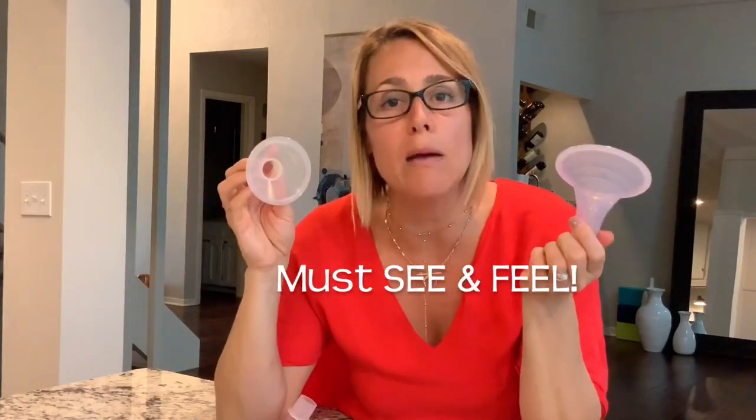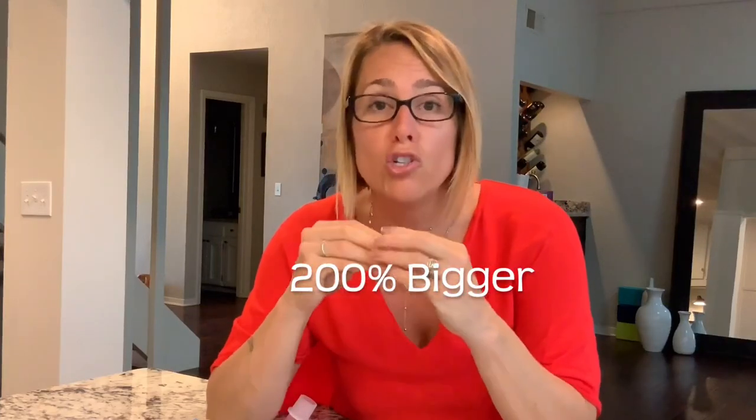Guess what? We can't look at a nipple and know what pump flange size she needs. We can't do that — we have to actually observe pumping. Because I can have a small nipple that gets really big with pumping, or a really large nipple that doesn't change much in size at all. In general, a nipple gets about 200% bigger during pumping and also during breastfeeding.